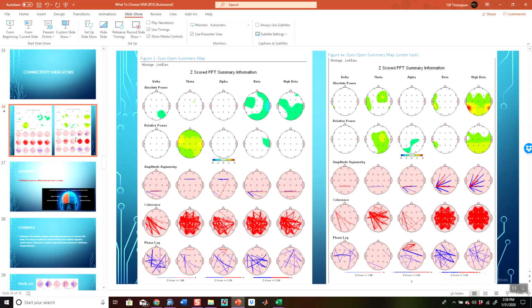So the directional part. So what do we have on the left and what do we have on the right? Is that what you're referring to? No, let's. I'm just trying to pull up an example of asymmetry.